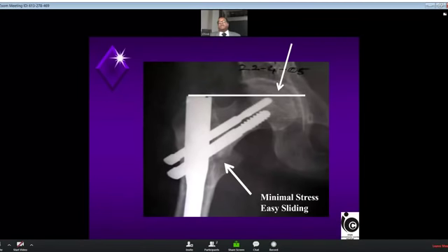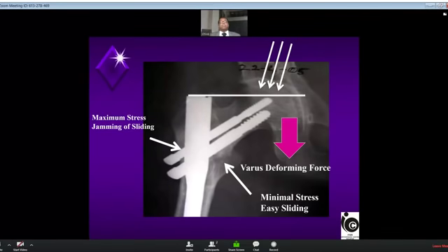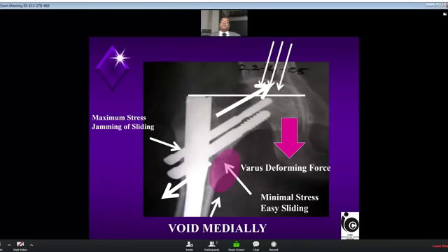The superior screw takes the brunt of the load and that will cause varus malformation forces. Instead of screw sliding out within the nail, the varus forces will be acting. The vector of the force will be more of varus deforming forces. That will cause the inferior screw to slide easily, but that will lead to maximum jamming and stress at the nail screw junction for the superior screw. So the inferior screw slides out and the superior screw slides inside, leading to Z effect.